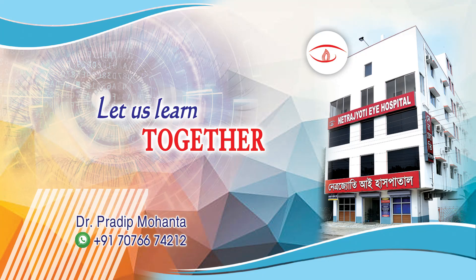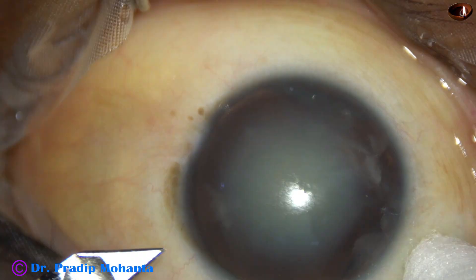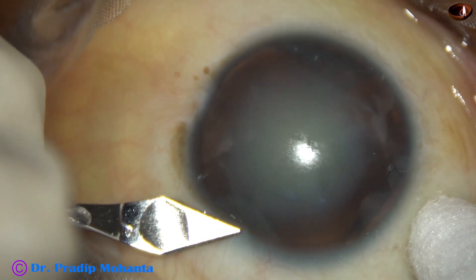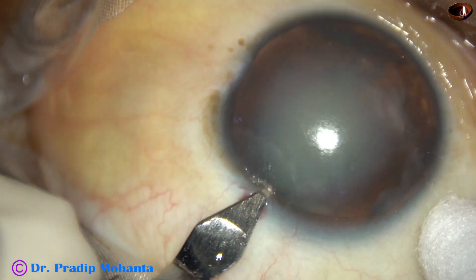Friends, welcome to my workplace at Ranagh Heart, West Bengal, India. This is a cataract with zonular tear from 8 o'clock to 11 o'clock. There is history of trauma. In this case, I have planned the main incision at 2 o'clock to avoid the area of zonular dehiscence.